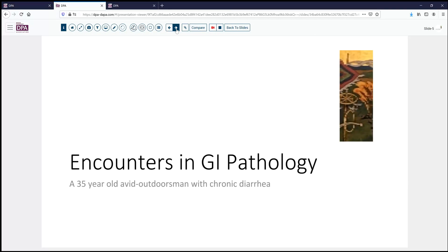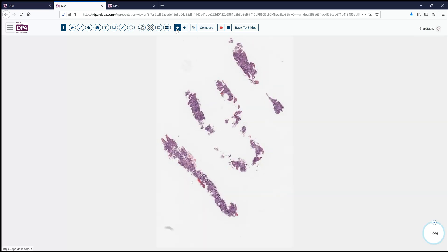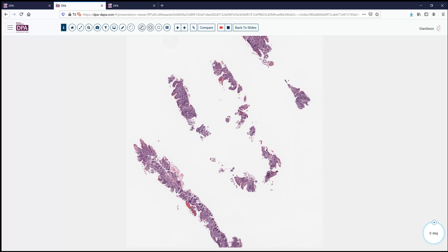Our case today comes from the realm of GI pathology. This is a 35-year-old who is a rather avid outdoorsman and over the past several months had some degree of chronic diarrhea resulting in even a little bit of weight loss. His internist referred him to gastroenterology and he underwent an upper endoscopy as well as various other modalities of testing. These are his biopsy samples, which at low power represent the typical fragmented duodenal biopsies.